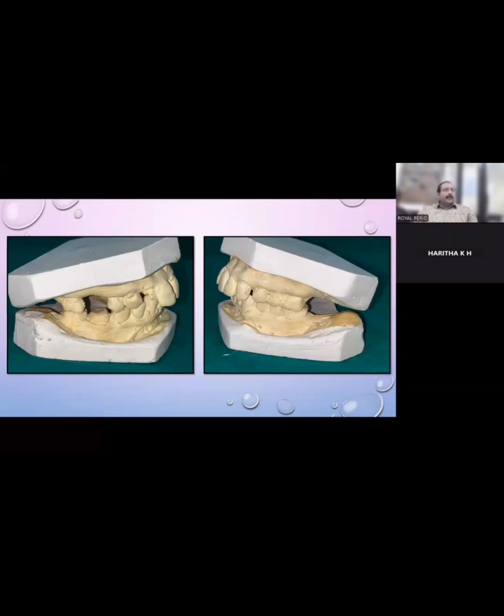So how many more millimeters to reach the sinus floor has to be evaluated. If everything is fine as per what you have shown here, then it should be somewhat short of the sinus floor. Little bit short of it, maybe 0.5 or 1 millimeter short. Yeah, okay, fine. So it is 6.5. Then what's next? 2.8 with the stopper, 6.5, then 3. Then 3.5.